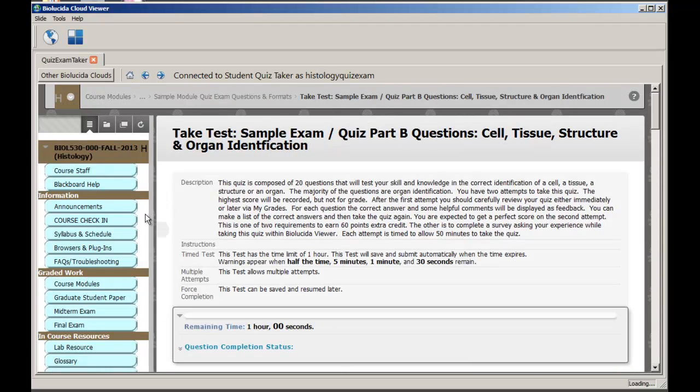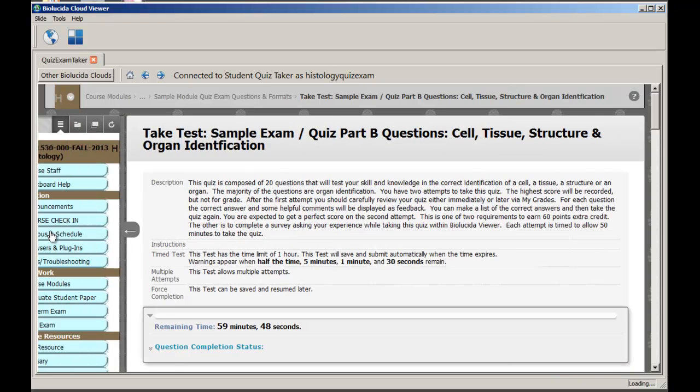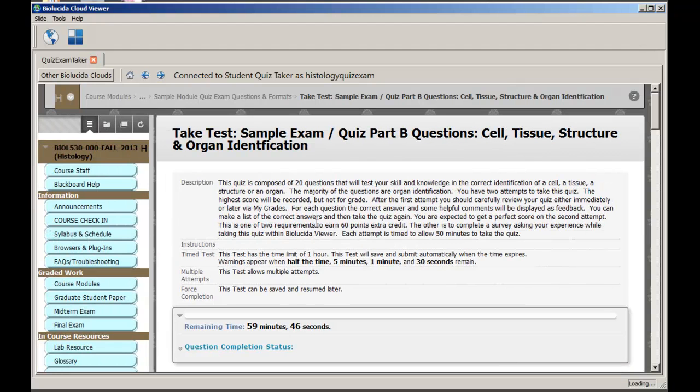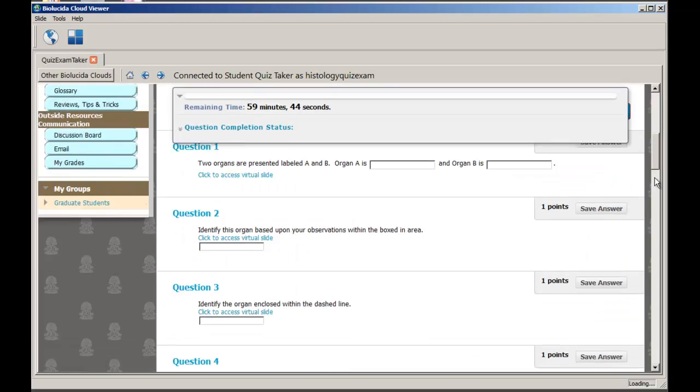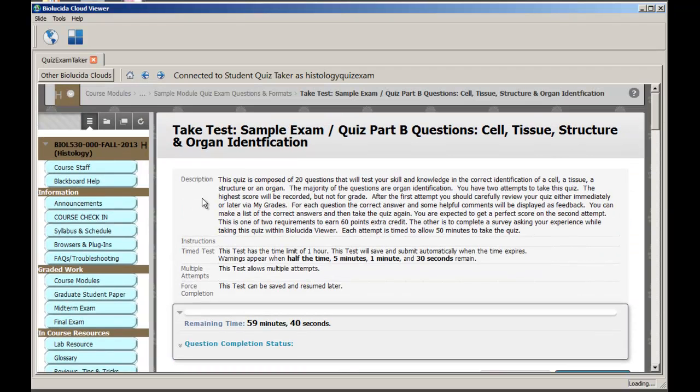And by the way, if you want more real estate, you can do this, and so you can have the whole thing like that. You have to hover your cursor, the little hand, over that and find the arrow. It's usually in the area by the menu, and you won't ever find it if you're way down here. When it shows up, just click it.